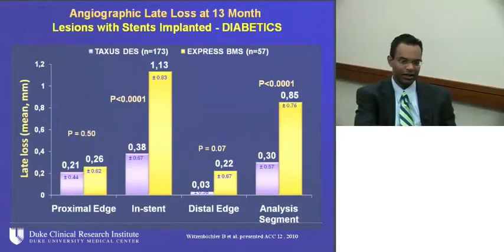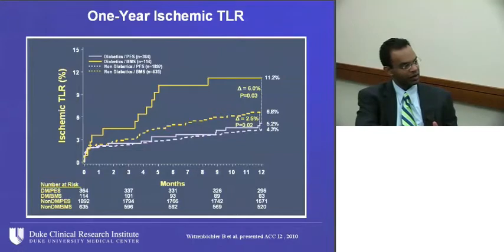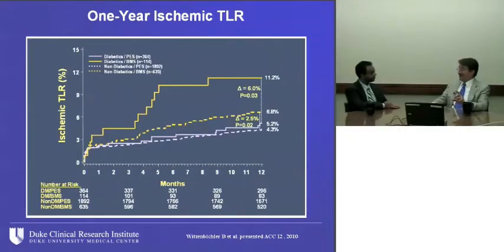One thing that's interesting about that slide, Mitch, is that what we just talked about where we saw almost twice the restenosis rates with angiographic follow-up in the diabetic versus the non-diabetic with DES. Here the rates look very similar. To what extent do you think that this is clinical follow-up, not angiographic, and or improvement in technique of drug-eluting stent placement, a little bit more attention being paid to apposition and so forth? I mean, the drug-eluting stents here in the diabetics perform very, very well. So I do think that there is a difference.